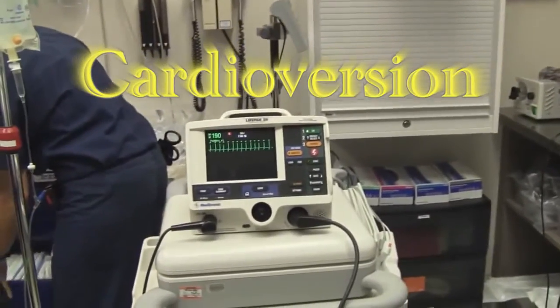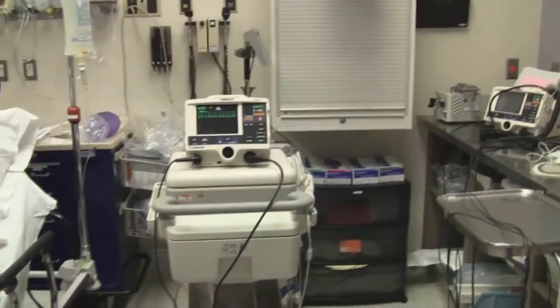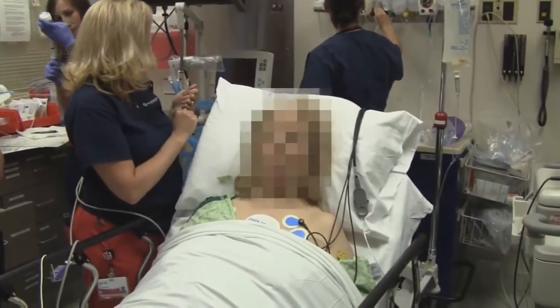So we're going to be doing a cardioversion here. We have an atrial flutter going on. So this is our patient — we're going to blur her face.